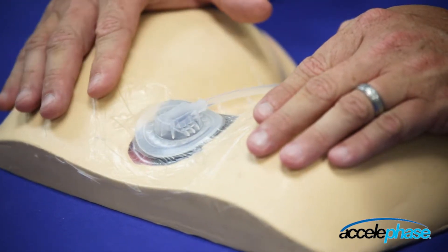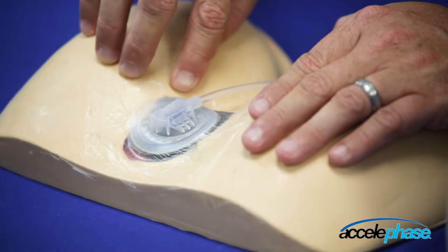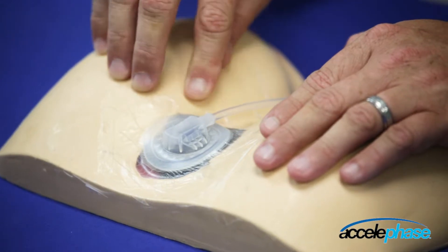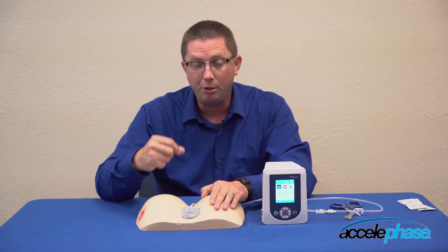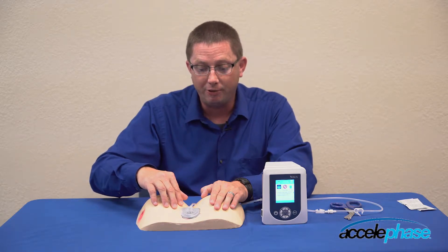This has not rectified my problem and I hear an air leak right here at the base of the wound. If you can't audibly hear an air leak, you can also use your stethoscope to identify the air leak.